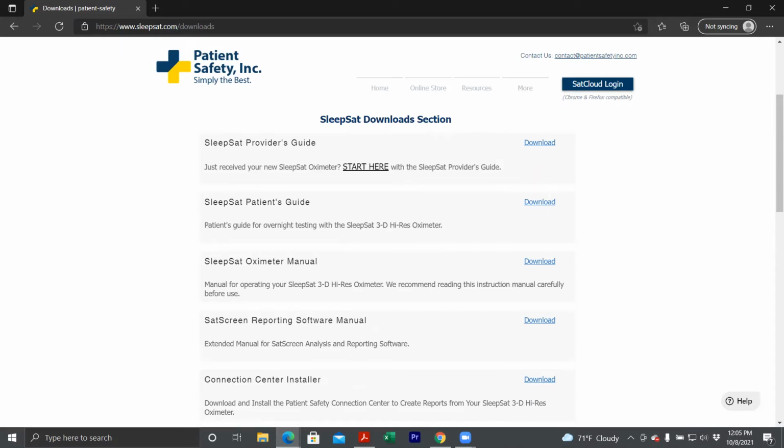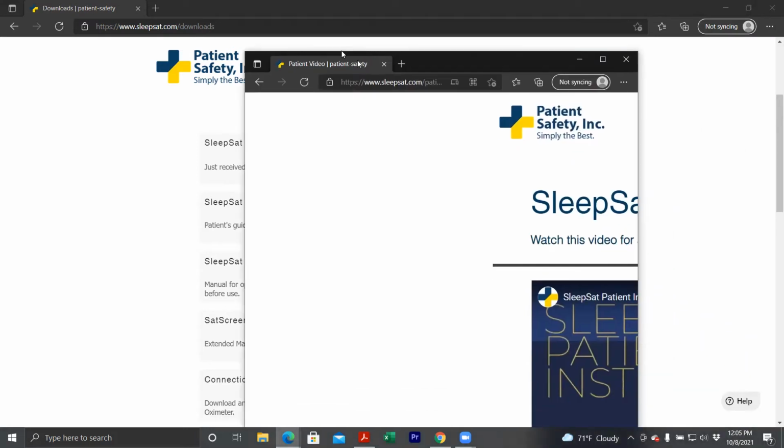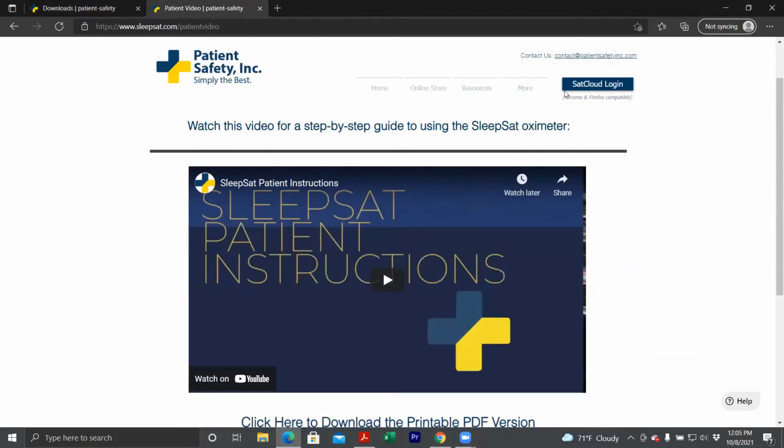But next, I would like to watch this patient video with you. We do recommend when passing out the SleepSat, watching this video with your patient, and making sure at the end of the video that they understand the full process.